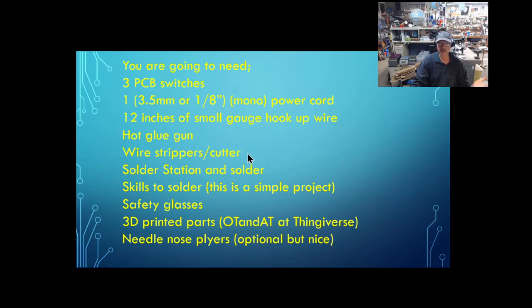A hot glue gun, wire strippers, a cutter, a solder station, and solder. Skills to solder. You can't just twist these things. You've got to make this repeatable and reliable, which means soldering it. And soldering is just a technique you have to learn. There's lots of help on the web and things to look at too. And really, once you have the fundamentals, it's very simple to do. Safety glasses. The cheapest insurance you're ever going to get. The 3D printed parts and some needle nose pliers are optional, but very nice to have.